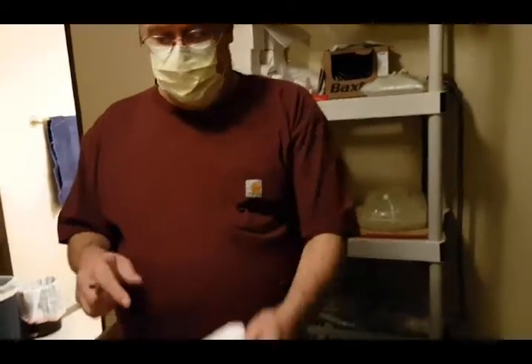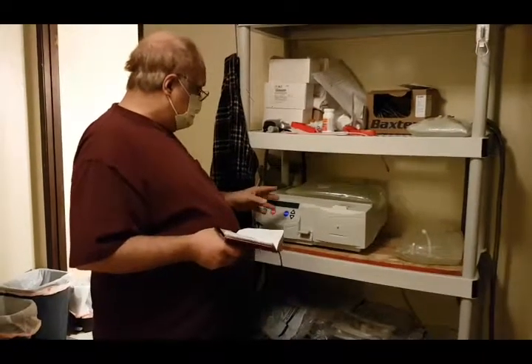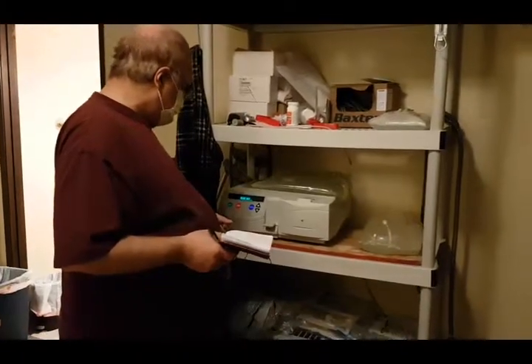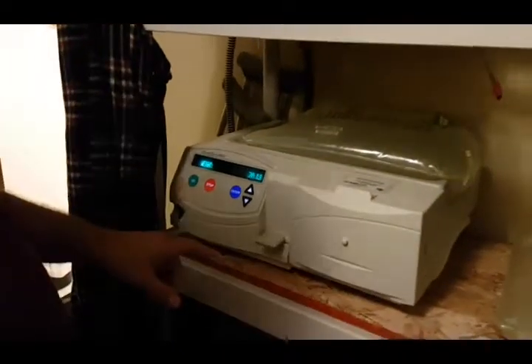Your book is over here. Okay. I have a book, a daily journal. Today is the 18th. 10, 18, 17. Turn the machine on. It's self-testing. I enter my weight.